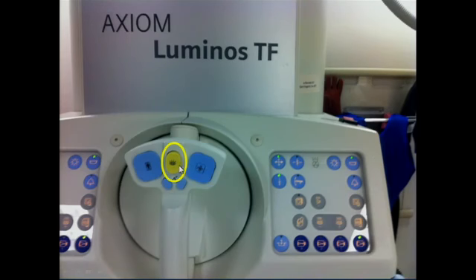This is our button for fluoro spots. And back in the II days, we had to use that because basically when you hit that button, you were taking a picture of the output on the image intensifier. But we have much less need to do that now where we've got a last image hold, where the image that was currently obtained while you were fluoroing on your pulse fluoro mode stays up on the monitor, and you can just ask the tech to save that rather than taking an actual fluoro spot. That image was acquired with 1/10 the dose of taking a fluoro spot.